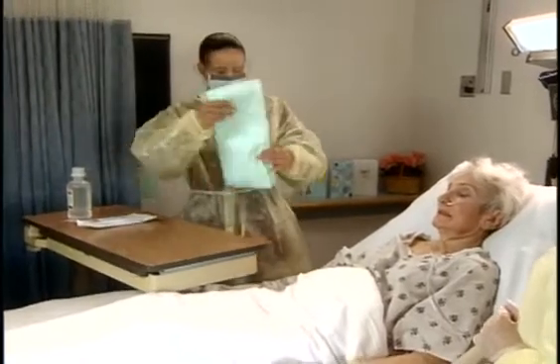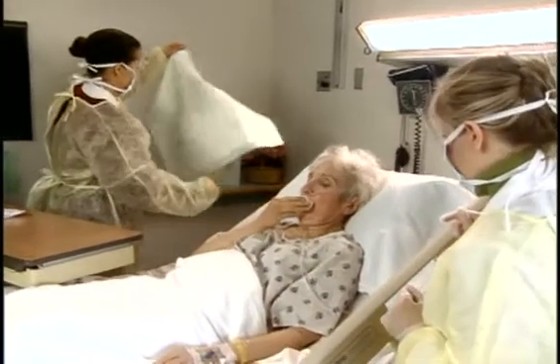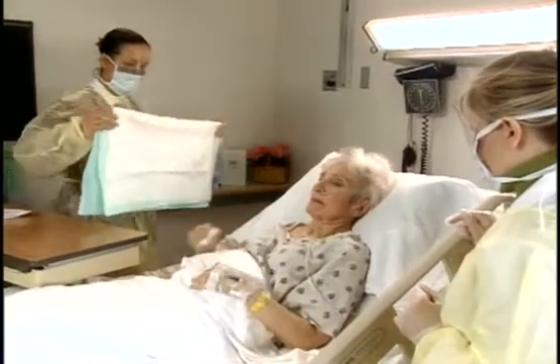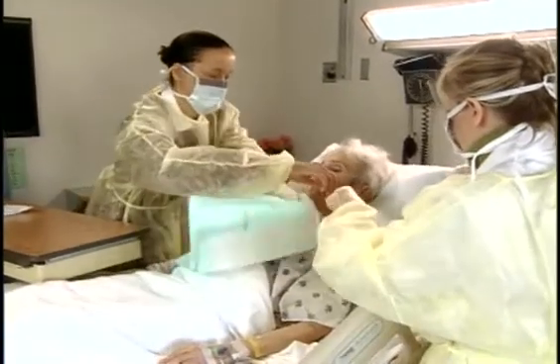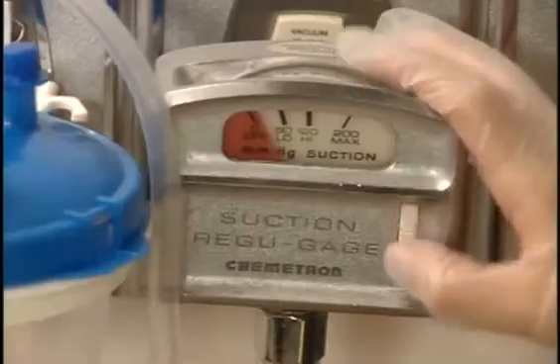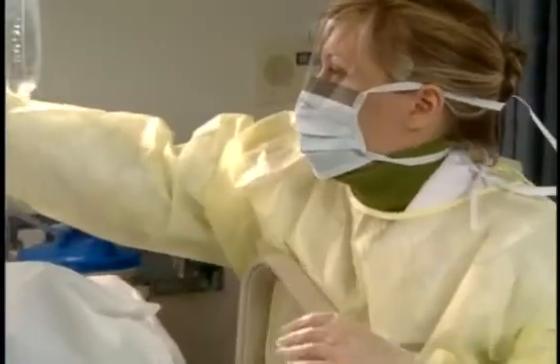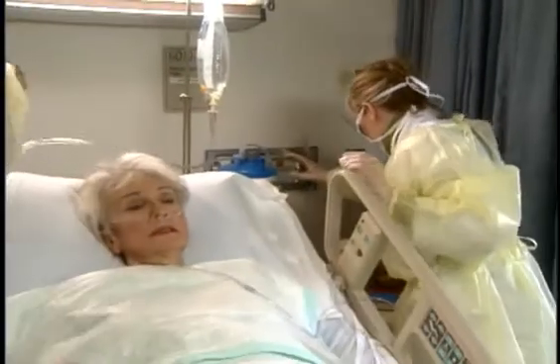And let's get this across your chest. All right, can you turn on the suction unit? Sure. Here you go. Now we're looking good over here.